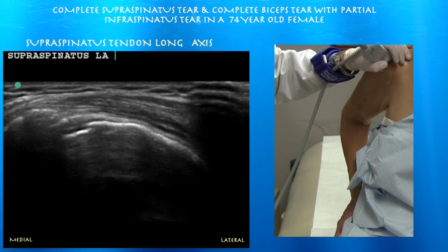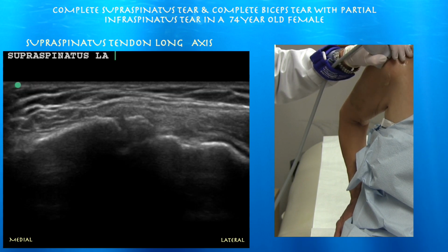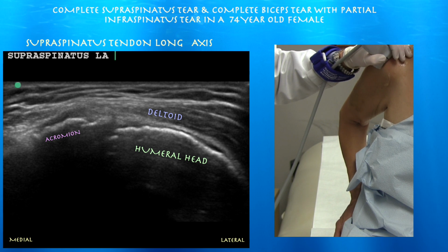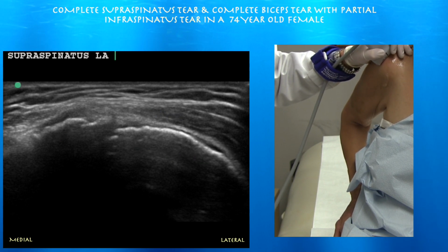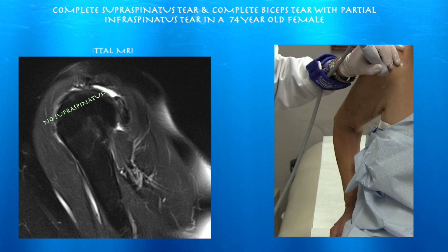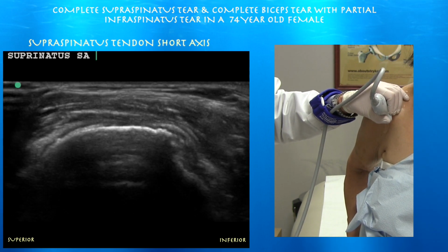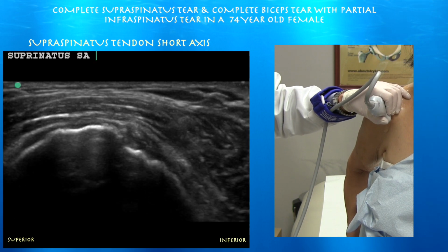Here we are, long axis view. Really just do not see any supraspinatus tendon. Just deltoid muscle right on top of the humeral head. You can see our acromion on the left side of the screen. I'm going to go ahead and do a short axis view now of the supraspinatus tendon. Left side of the screen is cephalad. You can see a nice cartilage interface sign here.